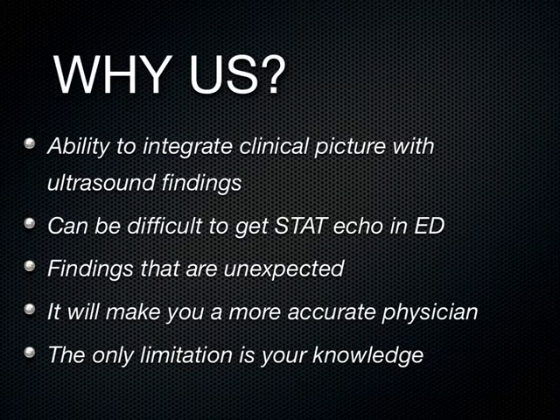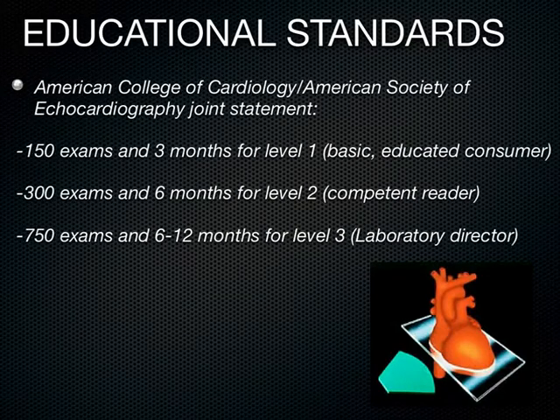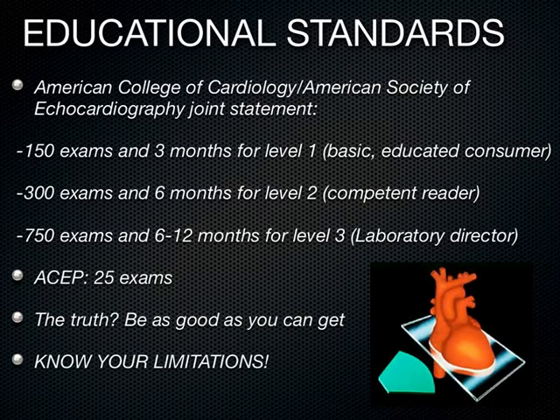Maybe it would have been delayed for a few hours, but the patient immediately went and had this procedure done 2 days ago. So that's a good reason to be doing this stuff. There are all these educational standards out there from the American College of Cardiology and American Society of Echo, but the American College of Emergency Physicians wants 25 exams. The idea is you want to get as good as you can and start to understand some of your limitations with cardiac ultrasound, which we'll get to.